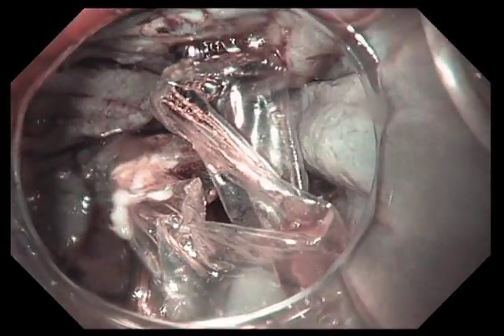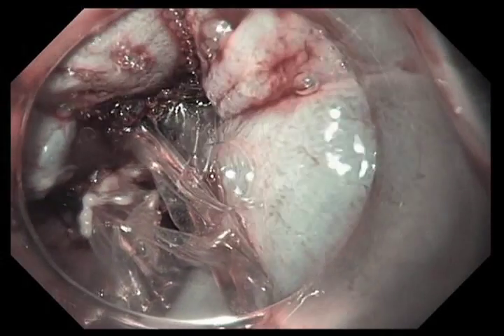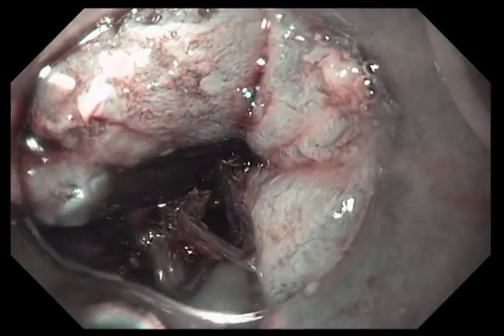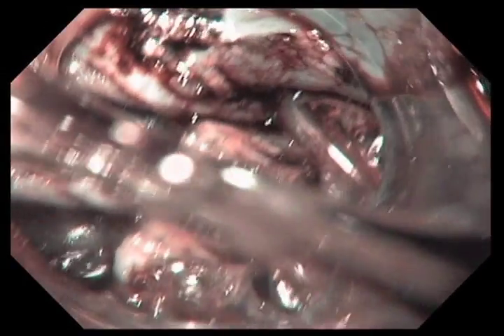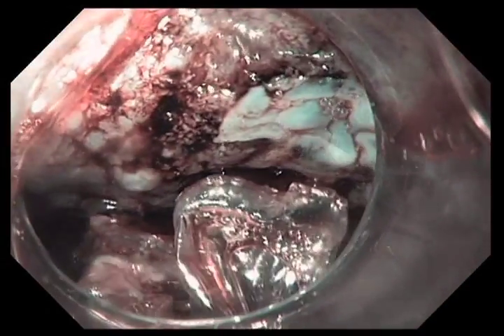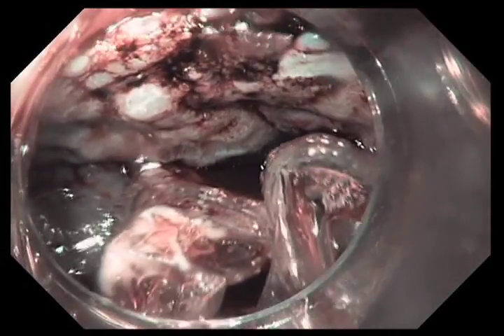This is quite friable now. You'll see peeling off a little bit of the coagulum, which produces bleeding. Blood with the NBI looks reddish in color, and that's why you see the red. We've treated the more proximal area, and now we're adjusting the balloon — we're going to pass it more distally to treat the distal end. We want to have just a little bit of overlap.